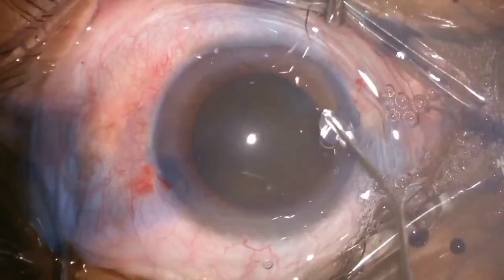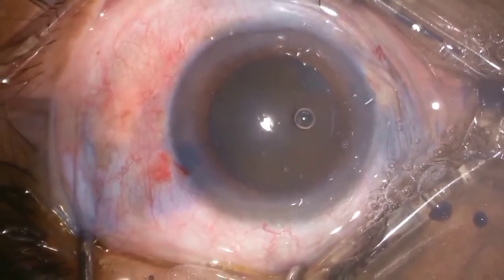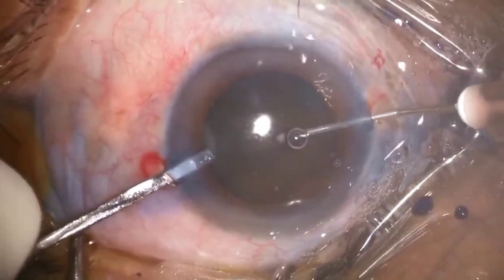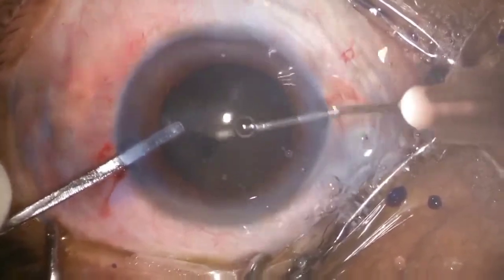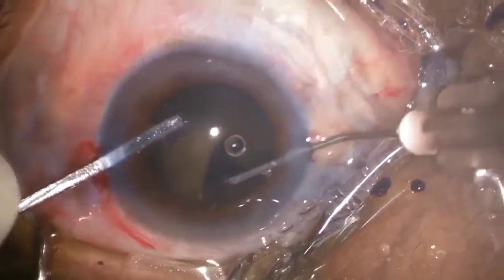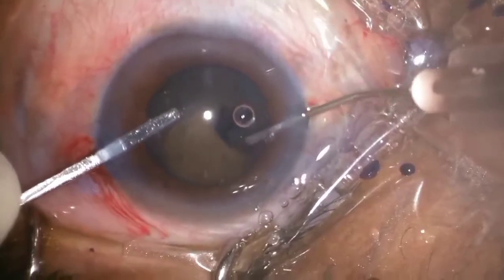So after forming the AC with visco, I decided to go for the capsulorhexis. I put the repositor on the left side and the cystotome on the right side. I started doing the capsulorhexis, and since the diameter was around 5 mm, I was going slightly larger than 5, around 5.5 mm.